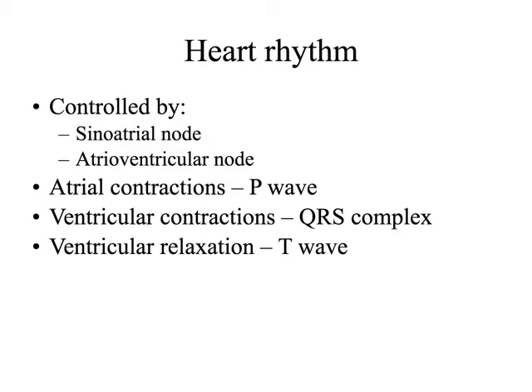Does that make sense? So I'm looking at this ECG, and I'm saying this is the distance here. I've had 5 or 6 heartbeats at that distance. Okay, that's where our time is at. Scanner, you take that and scan from that point, right? I've just really changed the way the timing of the scanner works. Kind of like in cath lab, when we go in and we do our gating, you know how we have to watch for 3 beats before we can even gate. Yeah. You can't even start it until you've watched to make sure there's 3 beats that are consecutive.